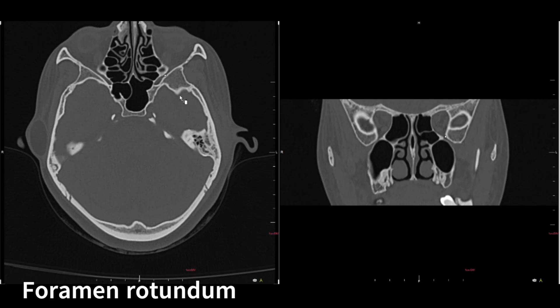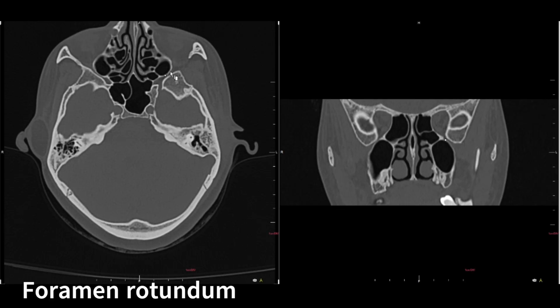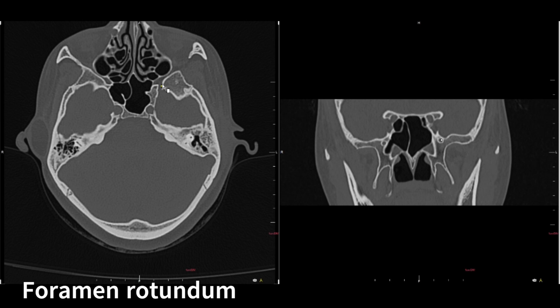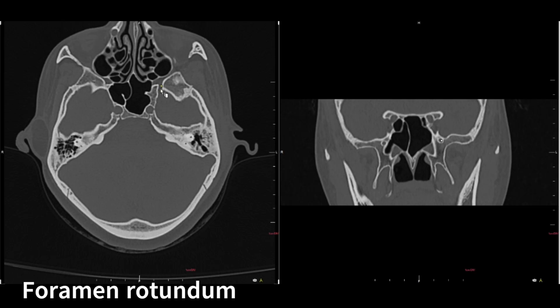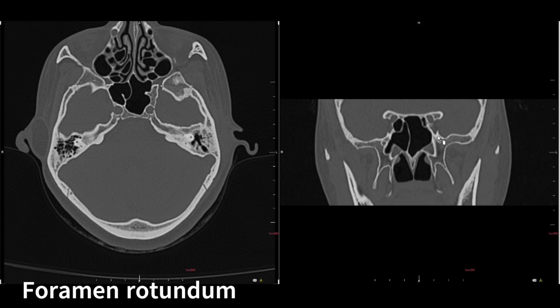Next foramen is the foramen rotundum. As you move down from the inferior orbital fissure, you can see the pterygopalatine fossa, and just posterior to it is the foramen rotundum. Adjacent to the sphenoid sinus on both sides you will see foramen rotundum, and it also joins the pterygopalatine fossa. On coronal, they appear as round-shaped structures adjacent to the sphenoid sinus, bilaterally well-defined. Posterior to the optic canal and superior orbital fissure, this is the foramen rotundum.